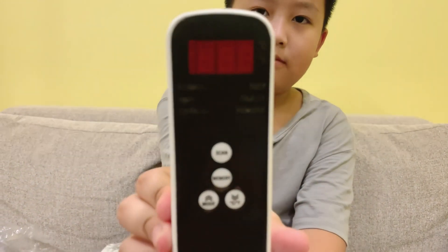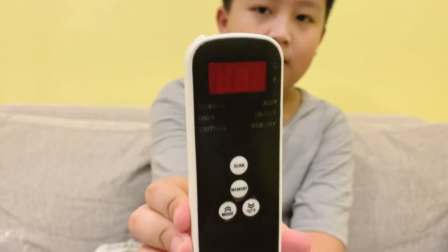One last time — here's the front, and now here's the back.